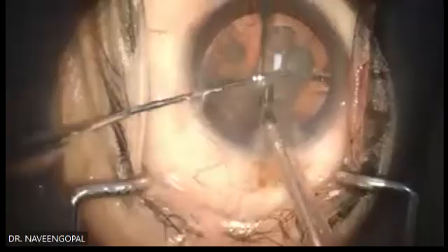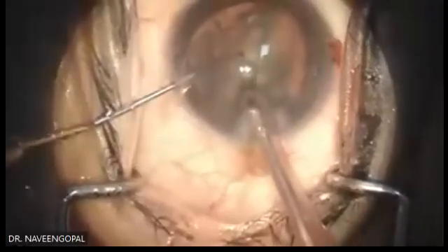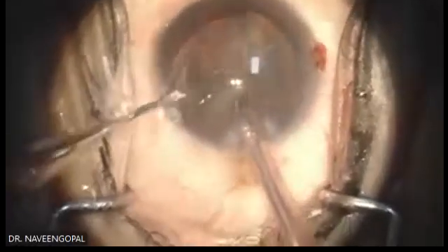Centration idea? Yeah. Centered? Yeah, yeah. Visible? Clear? Yeah, yeah. Chin down, center. Yeah, perfect.